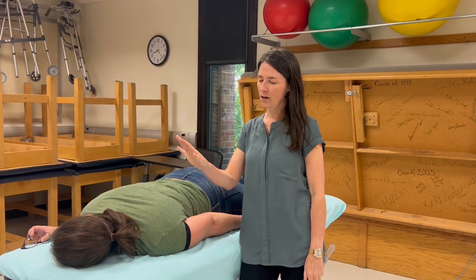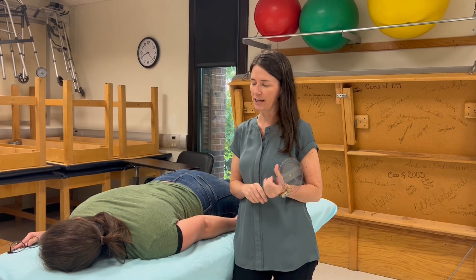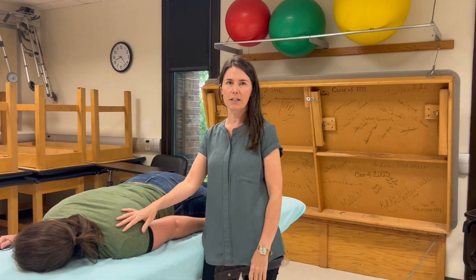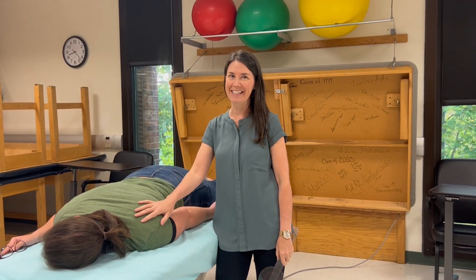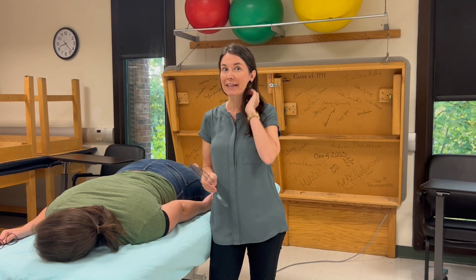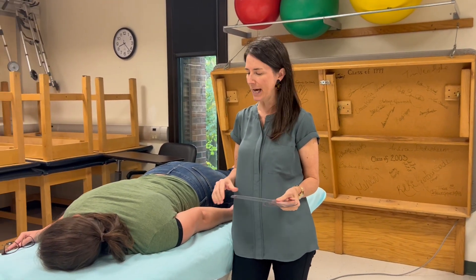We're going to start this video with goniometry for shoulder extension and then we will do MMT for shoulder extension. Shoulder extension happens in the sagittal plane. The end feel is firm and according to the textbook the normal value is 0 to 60 degrees. We'll see how many people actually have 60 degrees, but that's the normal value that's been established.